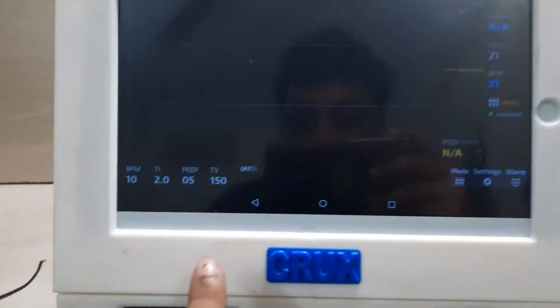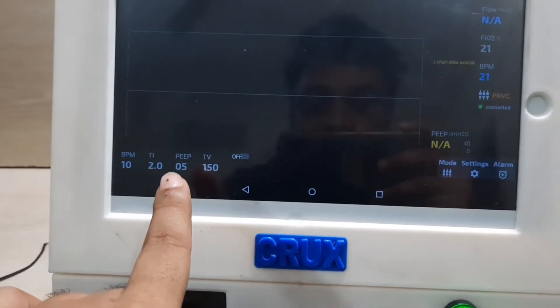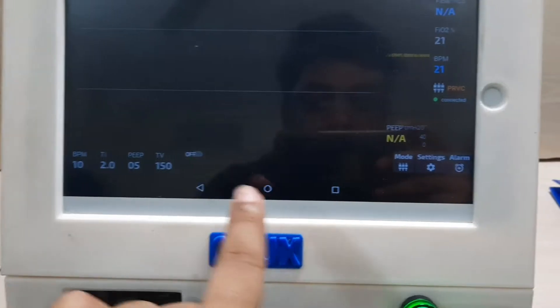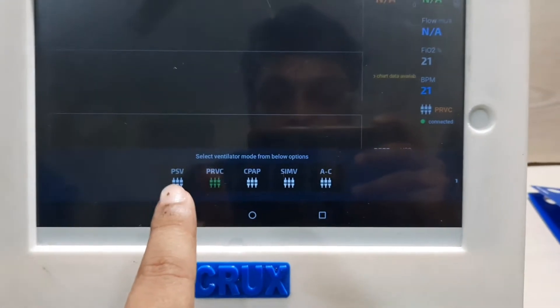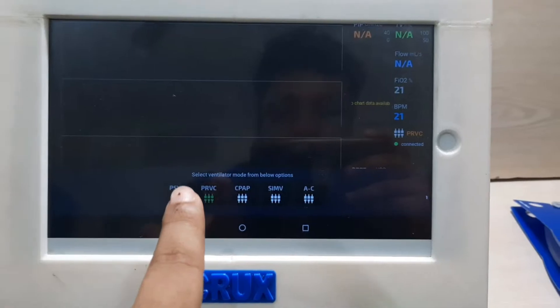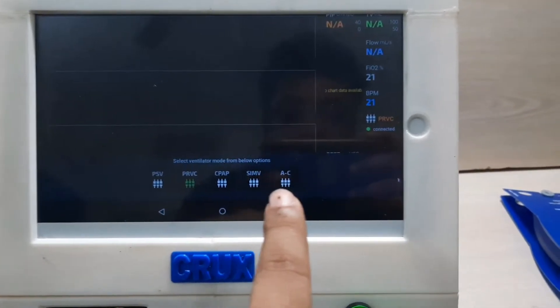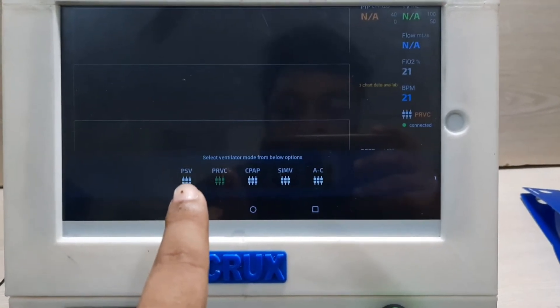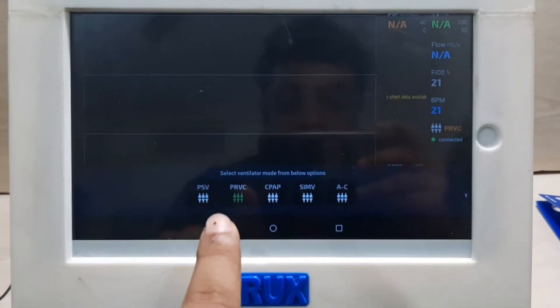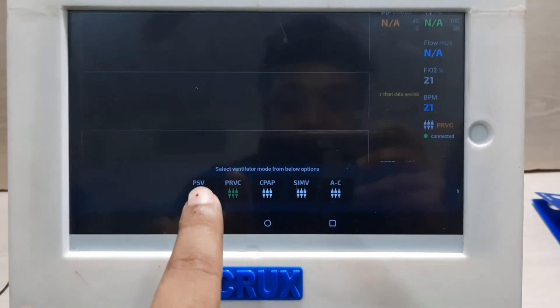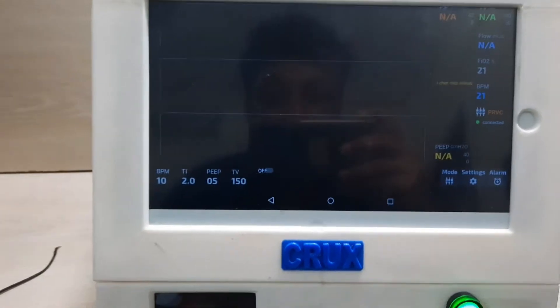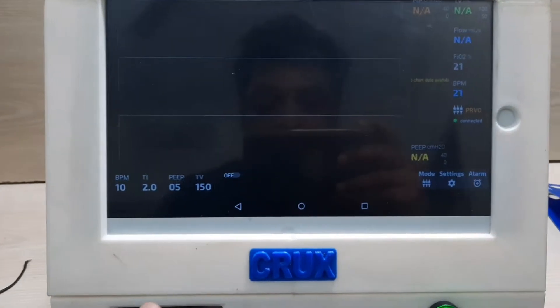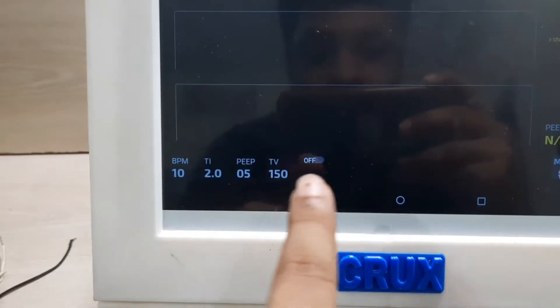Now here you can see the BPM, Inspiratory time, PEEP, tidal volume, and here is the mode. Here is actually pressure control ventilation or PSV — pressure support ventilation — PRVC and other modes, but for now PCV and PRVC is working. This mode should be called PCV, not PSV — we will edit this. So now it is in PRVC mode.